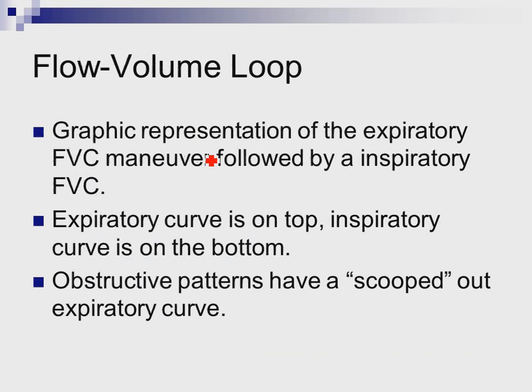That's right. We talked about the flow volume loop, where I basically have the patient take a deep breath in and maximally blast it out, and then take an inspiratory maneuver. What we're going to see, though, is that on a patient who has obstructive lung disease, the middle portion of this expiratory curve is going to be scooped out.